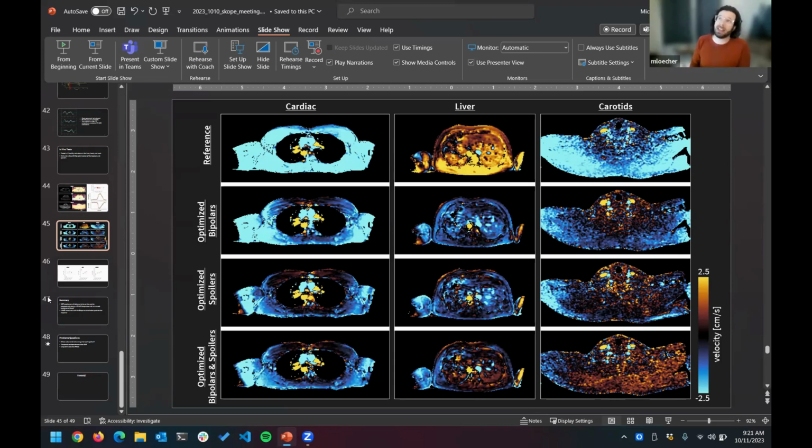Yeah, we could do it all. I mean, we haven't tried it all. The question is just whether we can make the GIRF from all of them. Basically, the process is exactly the same for the GIRF. You plug in the gradient waveform, you plug in your measured fields, and you just do a deconvolution. We're doing a Wiener deconvolution. So you really can plug in anything the scope spits out to make a GIRF from your gradient waveform to that field, and then use that in our framework.